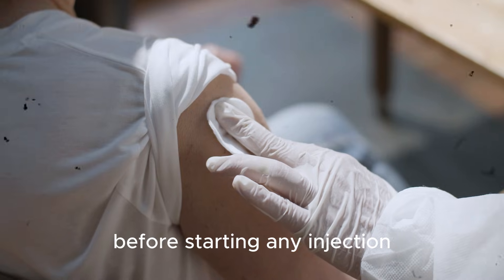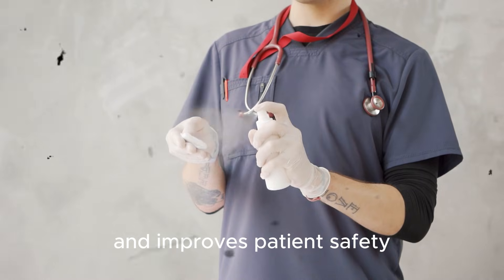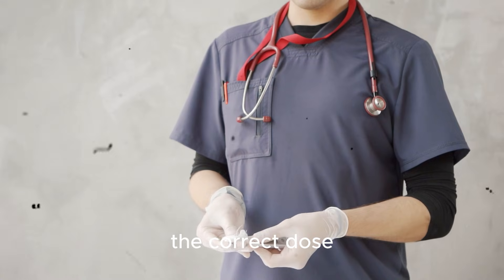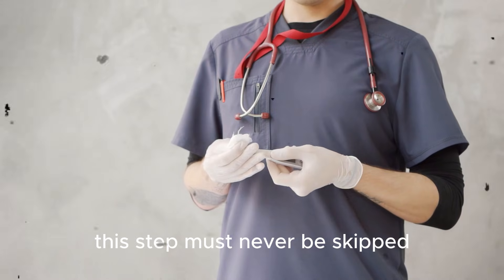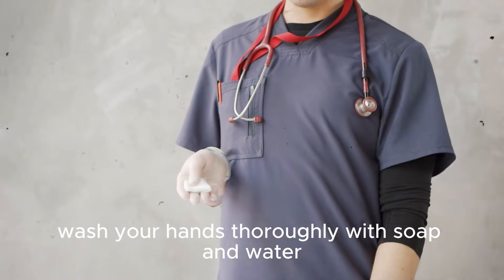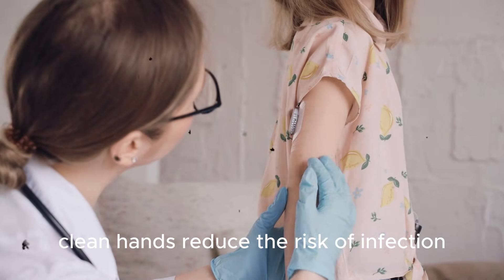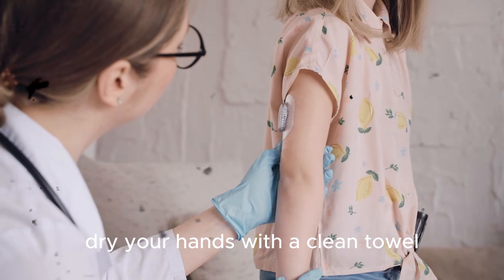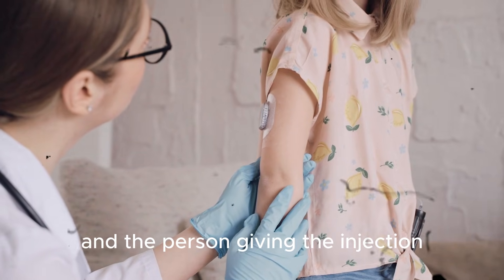Before starting any injection, the most important thing is preparation. Good preparation reduces mistakes and improves patient safety. Always begin by confirming the medication name, the correct dose, the expiry date, and the patient identity. This step must never be skipped — even experienced professionals can make mistakes if they rush. After verification, wash your hands thoroughly with soap and water. Clean hands reduce the risk of infection, and hand hygiene is one of the most powerful tools in healthcare. Dry your hands with a clean towel and put on disposable gloves, which protect both the patient and the person giving the injection.